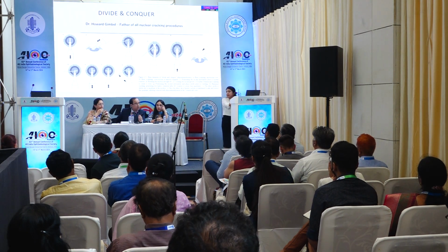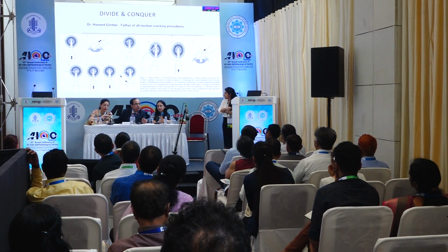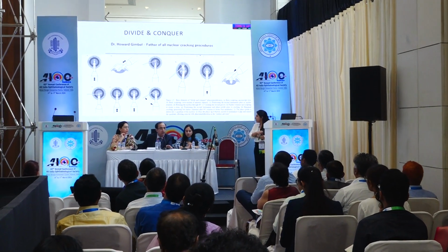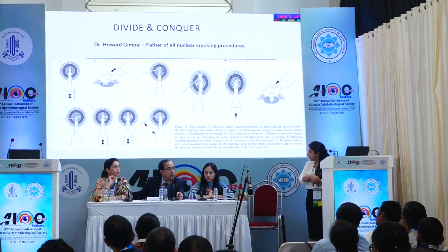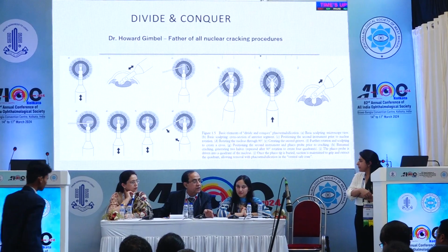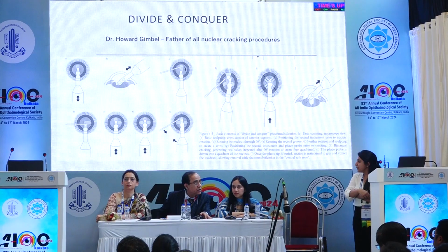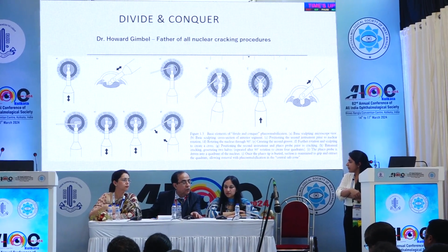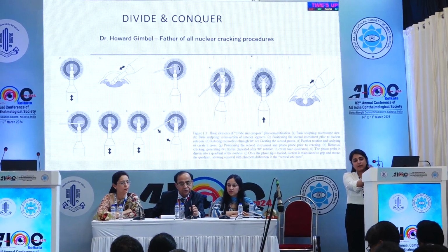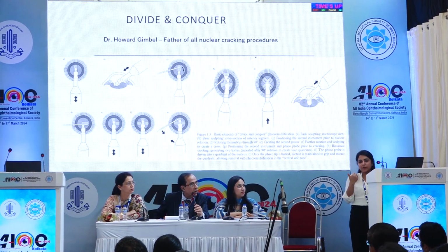So then the settings: how are the settings different in trenching, chopping, and Phaco aspiration? How will the power setting vary when you make a trench, and when you are chopping, and when after chopping you are doing the Phaco aspiration? Like I mentioned before, roughly the power setting is maximum when we are trenching, and the vacuum is low.